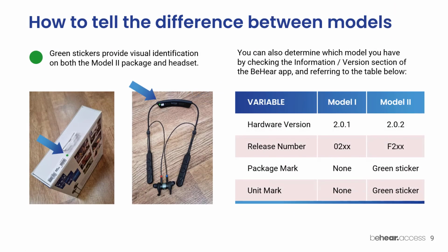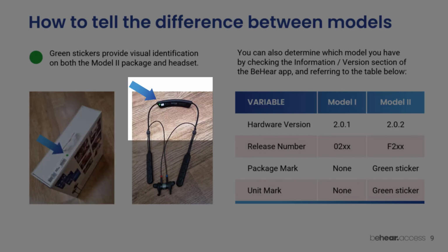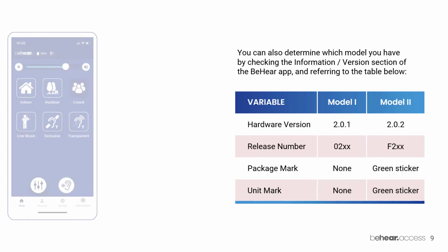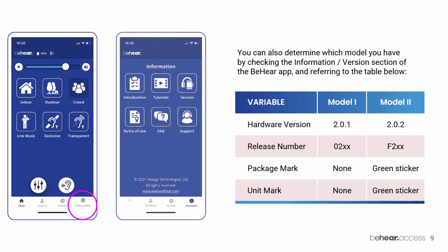We've tried to make it as easy as possible to differentiate between the models. Round green stickers on both the top of the product package and on the inside of the neckband indicate that you have Model 2. You can also check the version by pairing the BeHear Access with a smartphone and checking in the BeHear app. Go to the information menu and tap the version icon.